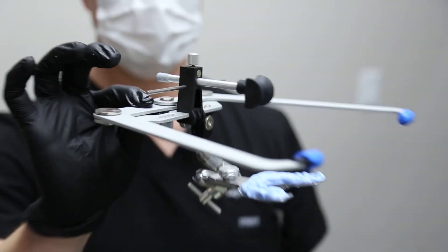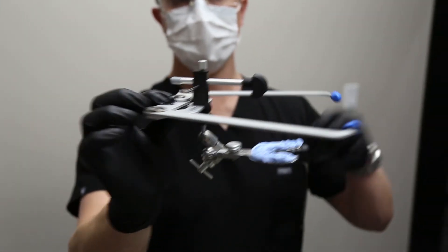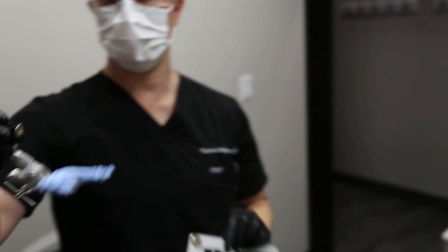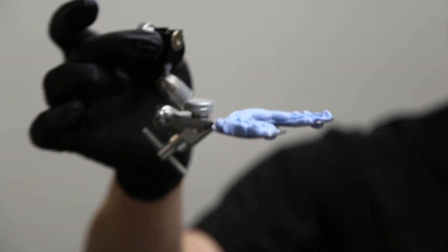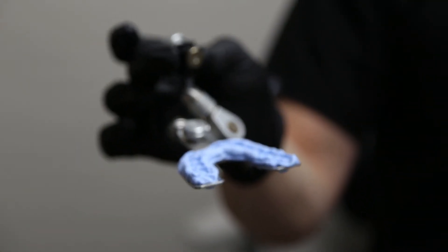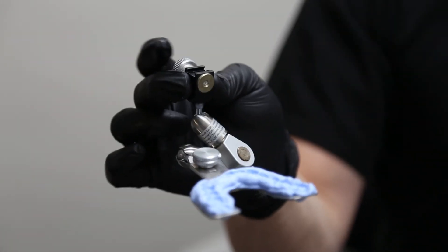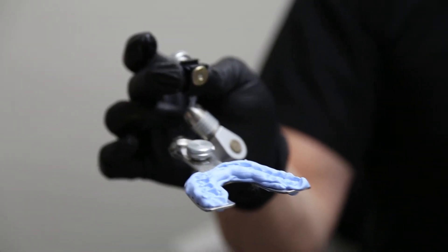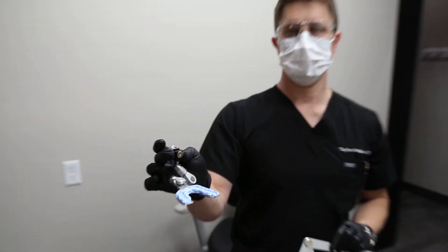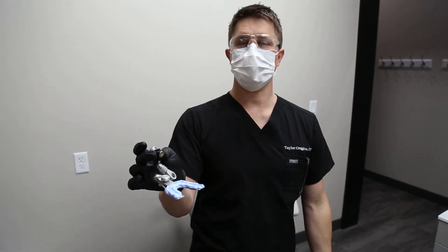This is how the face bow jig should look. The only information that needs to be kept is saved within the transfer assembly. This will be used to mount the upper model onto the upper member of the articulator. Pretty easy. If you have any questions, just replay the video and proceed as we did.